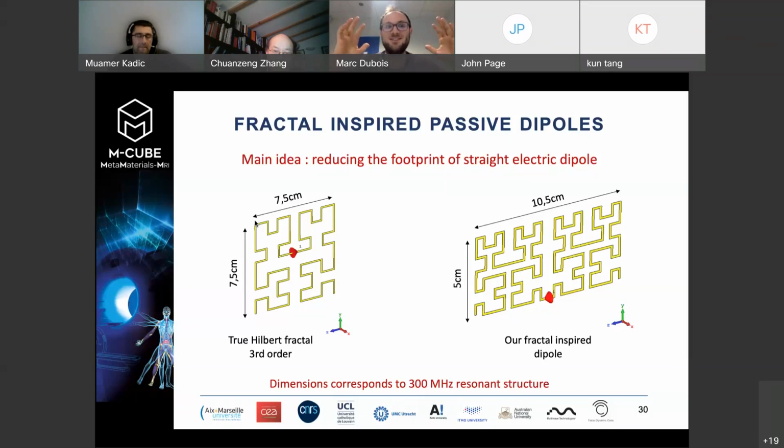It's really just, I'm just saying it like this. People are specialists of this, and they will kill me if they hear that. But just to give a perspective, you can follow metabolic processes with this. So that's really, really interesting. If you can measure phosphorus, you have this ATP molecule, and you can track how much ATP you have in the cells when you're doing exercise and stuff like this. So a lot of people, and actually MRI started with this idea of metabolic imaging first.